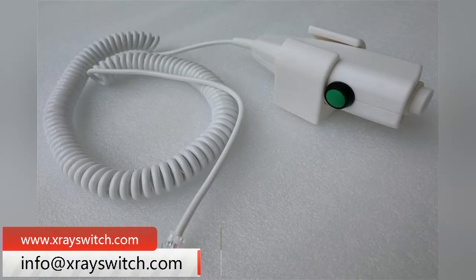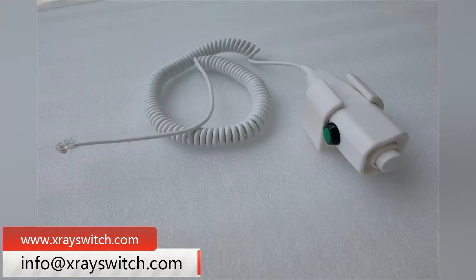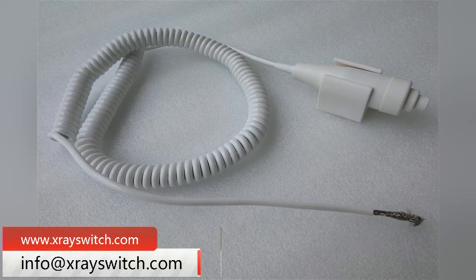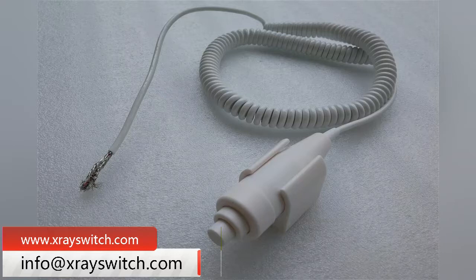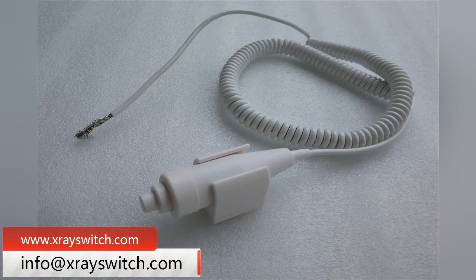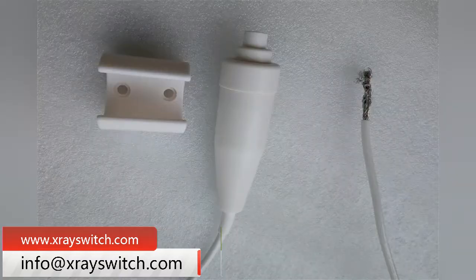High quality x-ray hand switch adopts high quality material and micro switch, which is durable and flexible. Newheek has 7 x-ray hand switch models, of which 6 wired x-ray hand switches are driven by mechanical press rod, and the x-ray hand switch components are also driven by Omron micro switch.